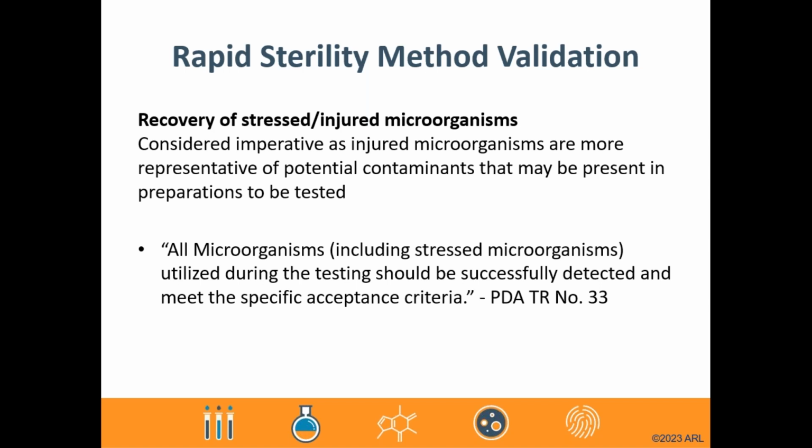Testing is then carried out similar to how it was for previous validation tests, in that both the alternative and traditional methods are performed using a sufficient number of replicates to allow for appropriate analysis.